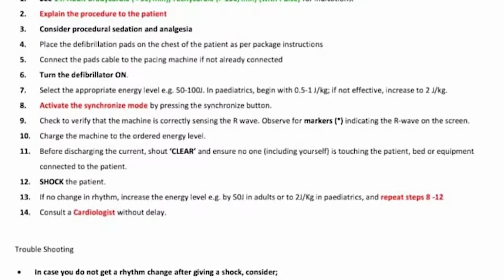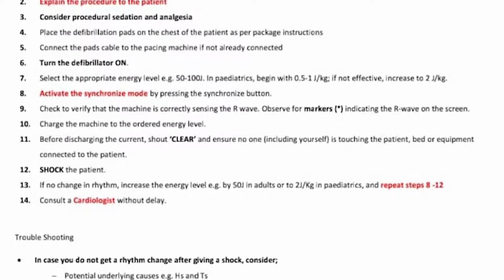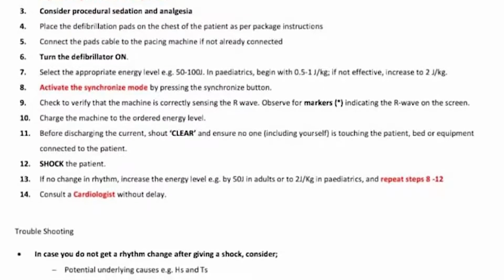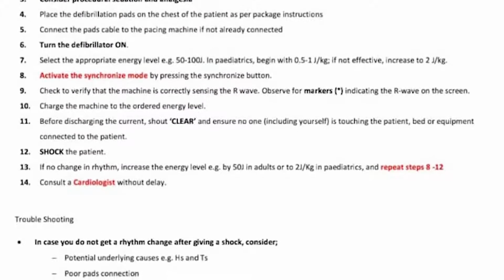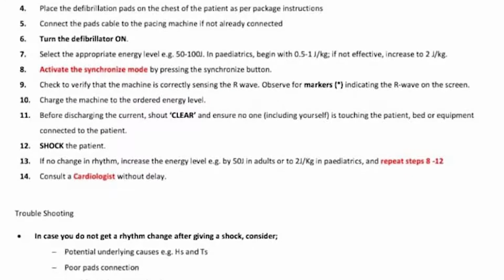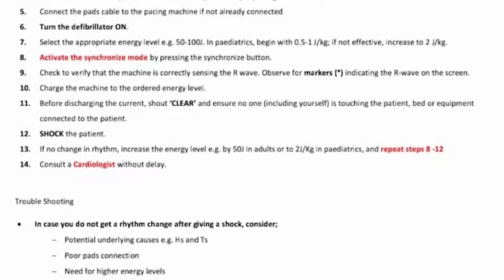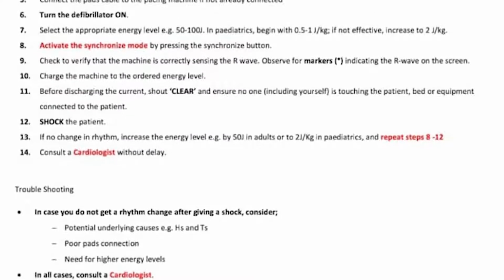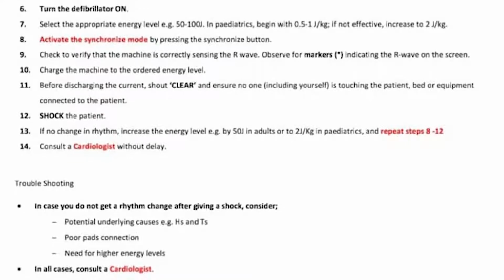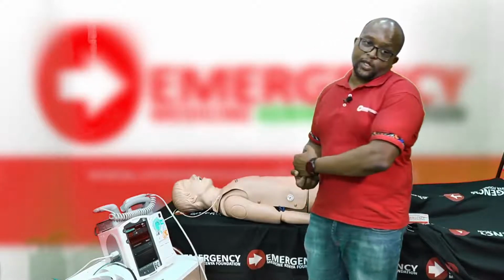In a ventricular fibrillation, cardiac arrest situation, no need for that. But this patient is alive. So sync, markers, select energy, okay, and then shock on expiration. And if it doesn't work the first time, then again, start again from the top. Make sure your sync is on. Make sure you can see the markers. You move up, for adults, you move to 150 joules. Okay, from 100, maybe go to 150. And then shock on expiration.